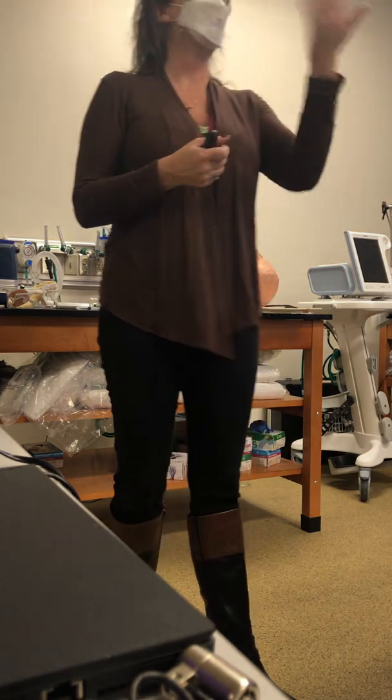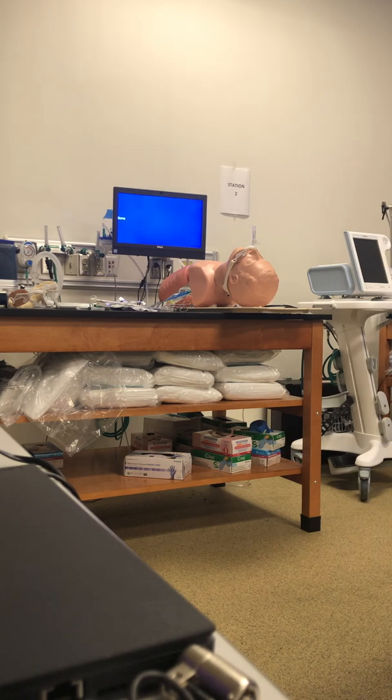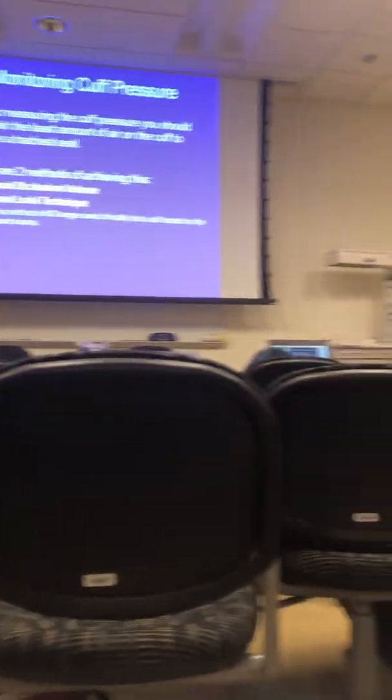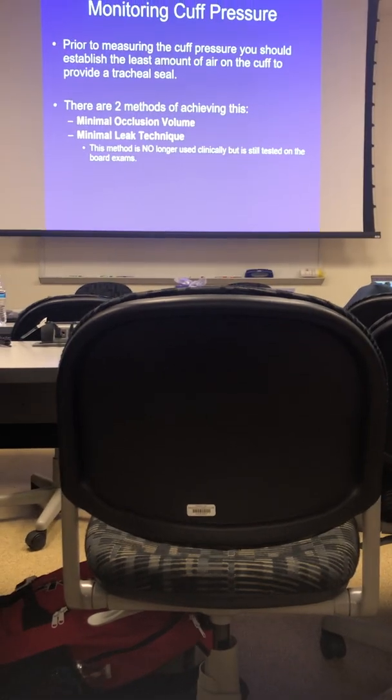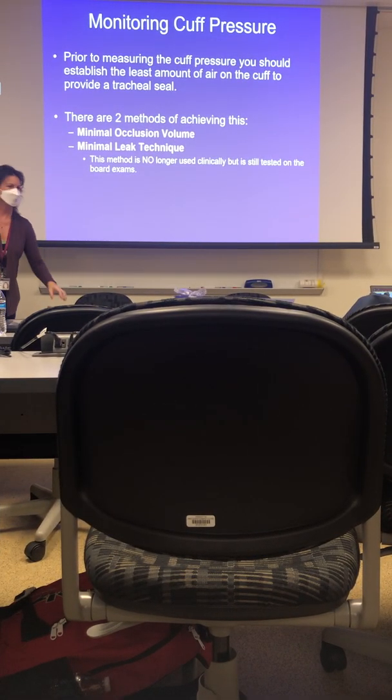I need you to give me some explanation. You've got to think of something. You've got to talk really loud. Can you repeat what you said? I said, why would I want to do a minimal leak technique? What is a minimal leak technique?